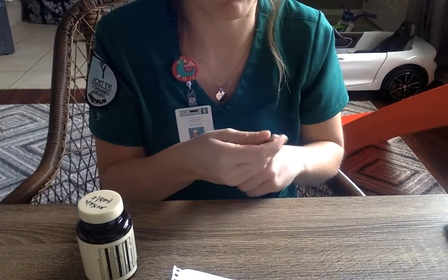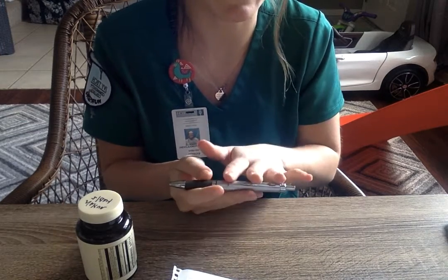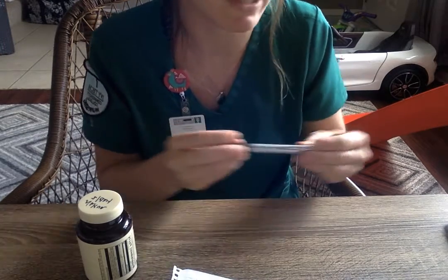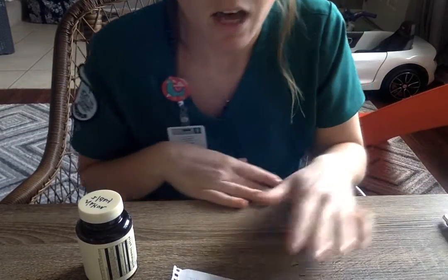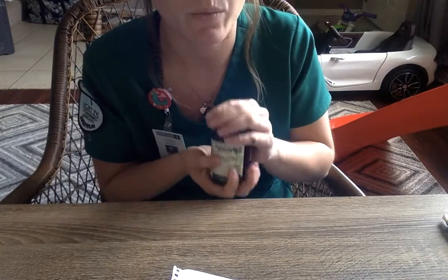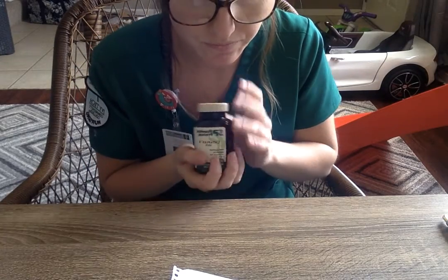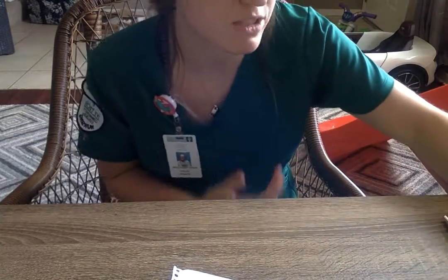I would do the safety precautions for it. I would label the syringe, date, time, the right medication, so I know which one is which, and I would set that aside. Also, if this, again, was a multi-use vial, I would date and initial it, just to make sure that the next person that uses it knows when it was opened last, so it wasn't expired.